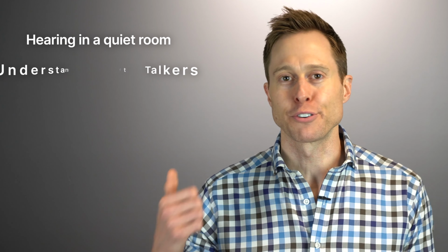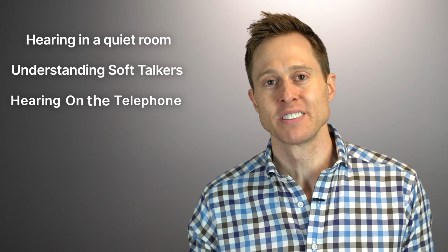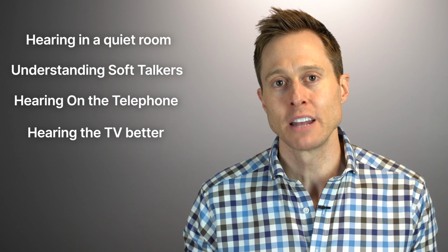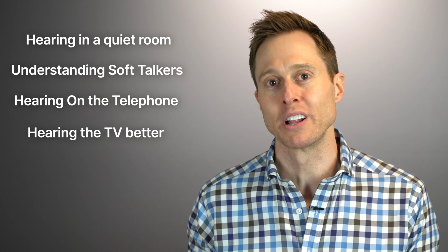I'm sure it doesn't shock you, but the #1 priority for individuals who have hearing aids is better hearing in background noise. Modern day hearing aids have pretty much solved everything else, from being able to hear someone in a quiet room, understanding soft talkers, hearing better on the telephone, and even hearing the TV better, as long as you have the right hearing aids fit and programmed properly using real ear measurement.